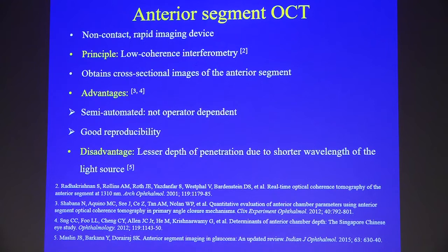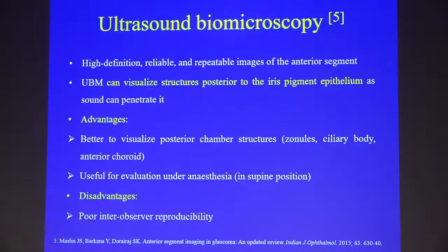My speakers' predecessors have already covered this, so I won't go into the basic principles. I'll just tell you the advantages: semi-automated, not operator dependent, and good reproducibility. Disadvantages, however, are lesser depth of penetration due to the shorter wavelength of the light source.